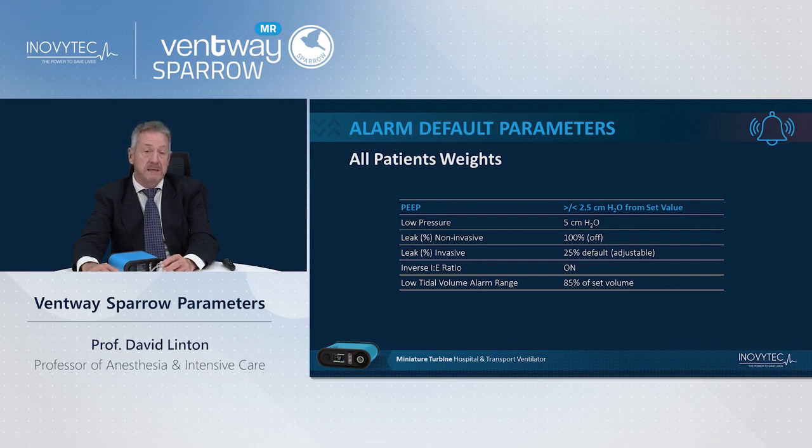The big mistake clinicians make is to set a PEEP level and think that that's what the patient is getting. You have to have a monitor of the PEEP level at the patient's mouth to know what the machine is delivering in terms of the flow and expiration and dumping pressure in the circuit.